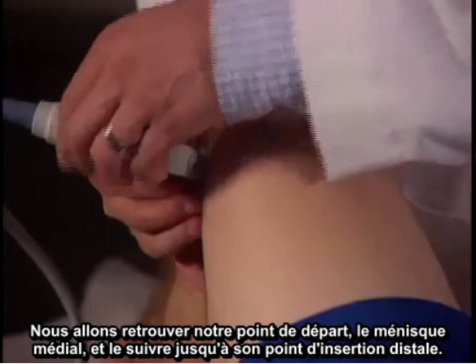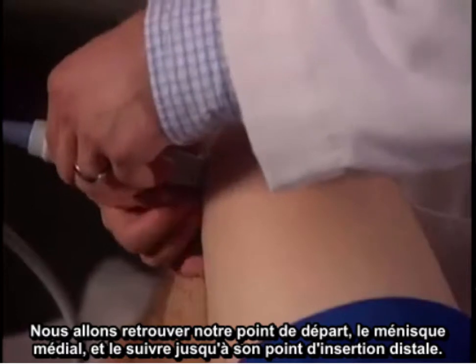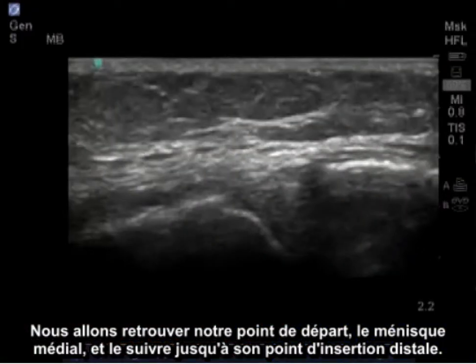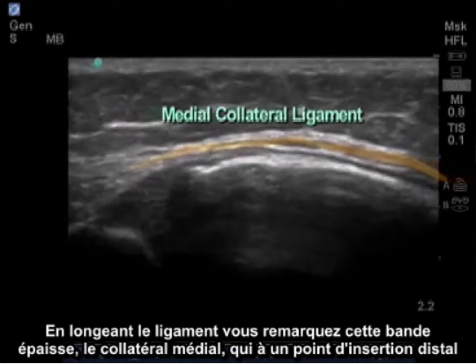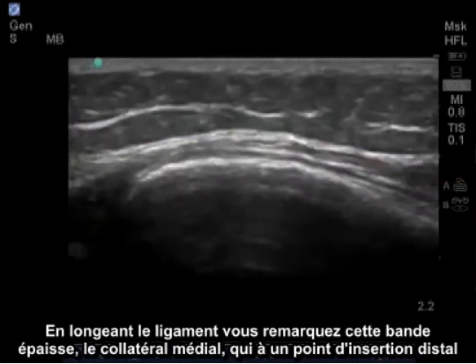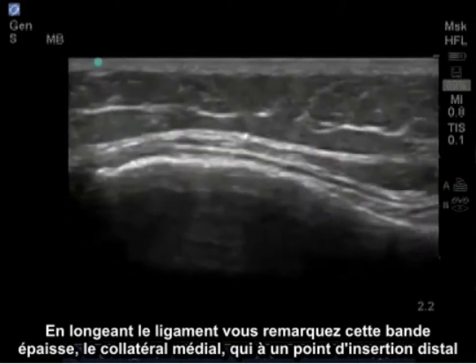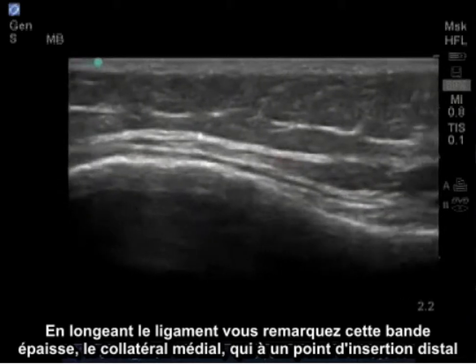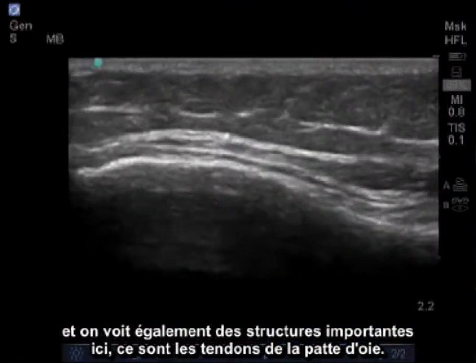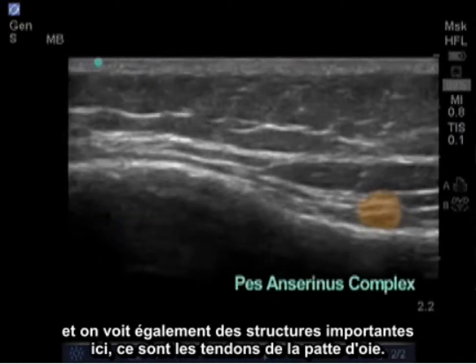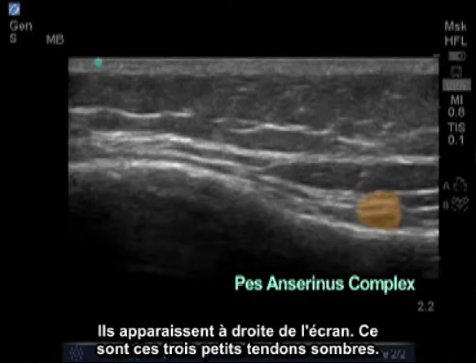We're going to begin at our starting point, which will be the medial meniscus, and follow it distally along to its insertion. Following along here, you see the thick band of the medial collateral ligament — it actually inserts quite distally. And what we can also see down here are important structures known as the pes anserine tendons, which appear as three discrete tendons.